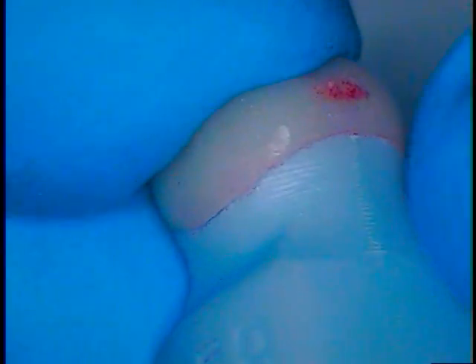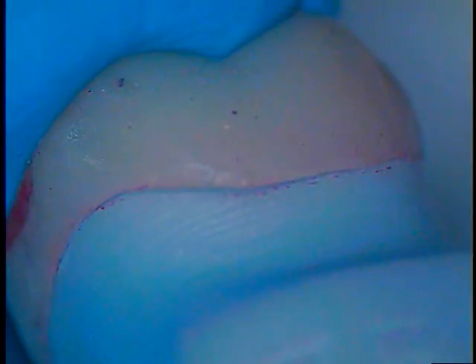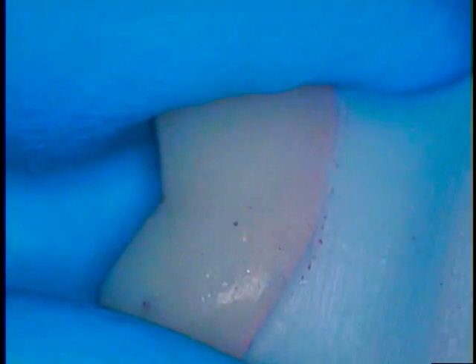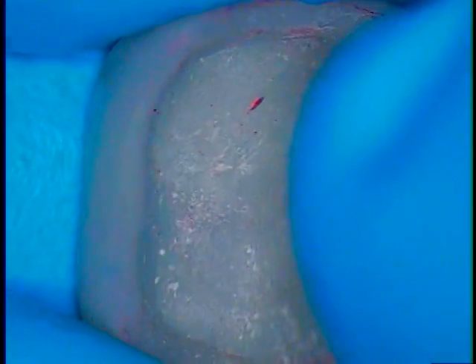Well, looks like we've got an almost exact fit. It's not quite seating all the way. So there's something internally holding us up, and we would have to find that out by adding an indicator in there.